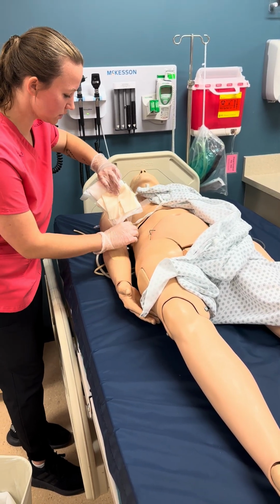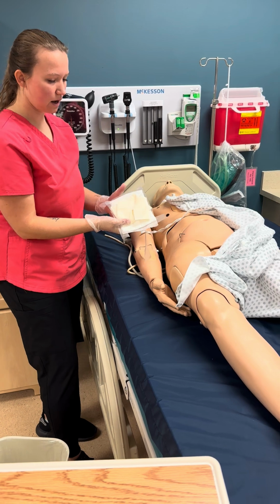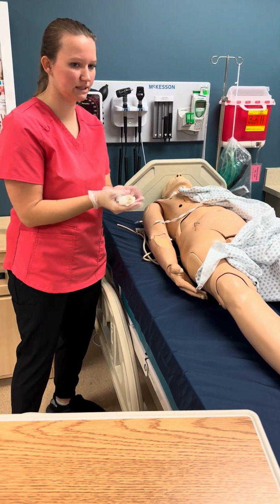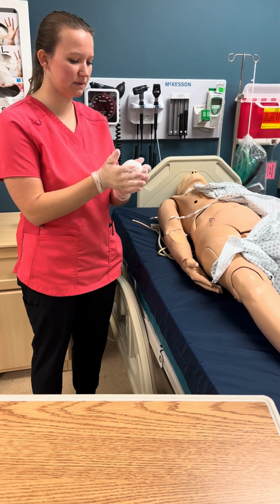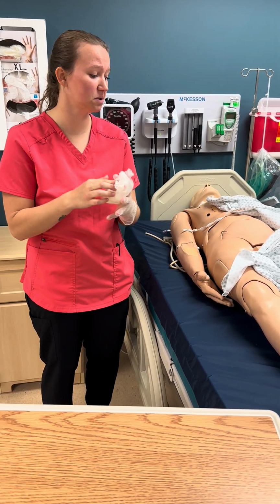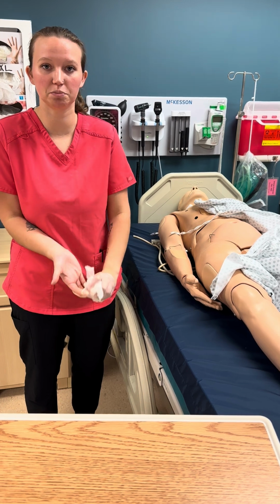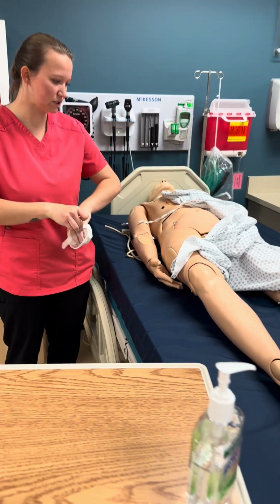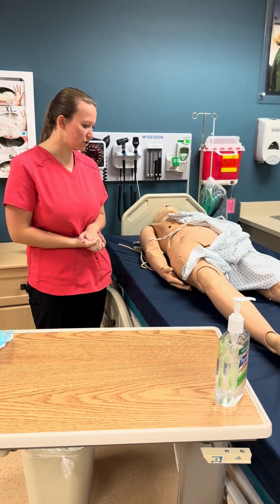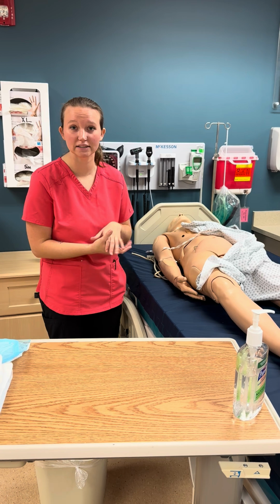All right, so I'm going to note that we have a surgical wound here in the right lower quadrant. I don't see any exudate or drainage on the packaging here, so I'm going to put that nicely in the garbage. I'm going to note the different types of fluid. There's serous fluid, which is thin, yellow, clear, watery-like. There's sanguineous fluid, which is bright red and indicates fresh bleeding. Serosanguineous fluid is a combination of serous and sanguineous fluid. And then we have purulent drainage, which can be green or yellow, thick, can indicate signs of infection, and can have a distinctive odor as well.